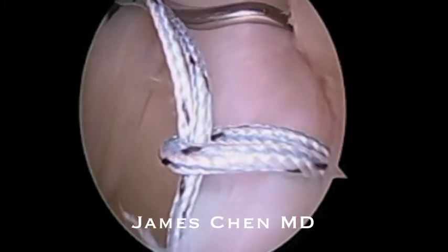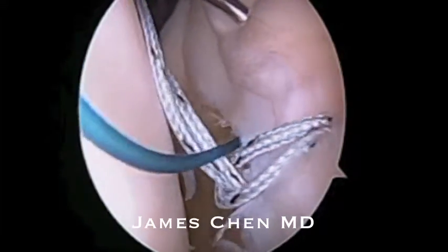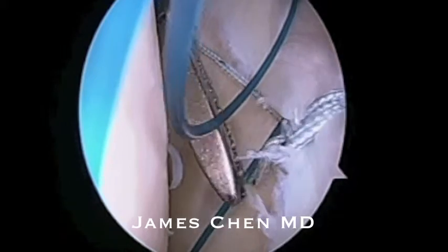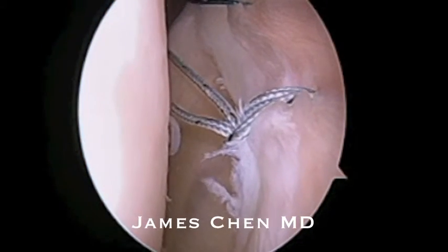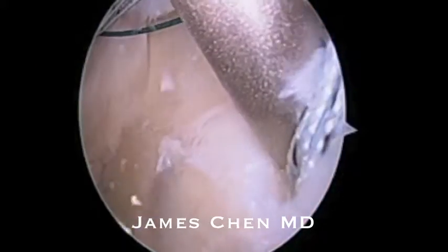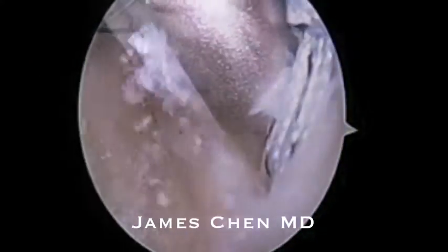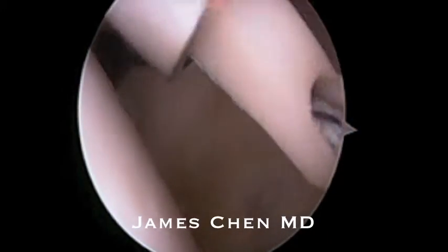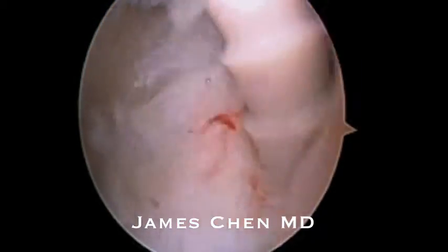I am then passing another suture anterior near the base of the biceps, retrieving it through the anterior portal, and then docking this outside the anterior portal. I am then drilling a pilot hole for the anchor. I have loaded the anchor with suture and I am now malleting this into the glenoid.